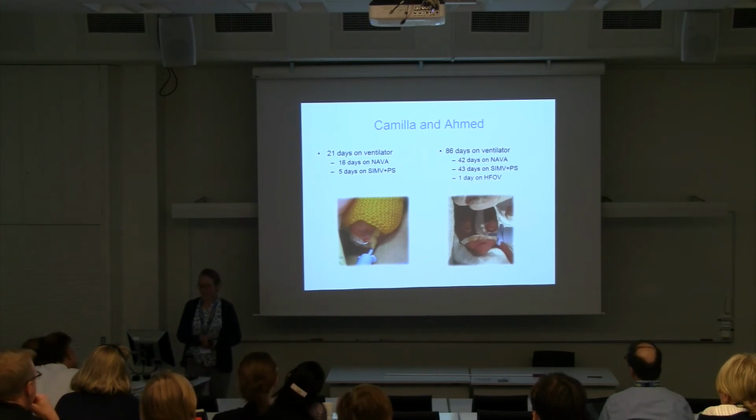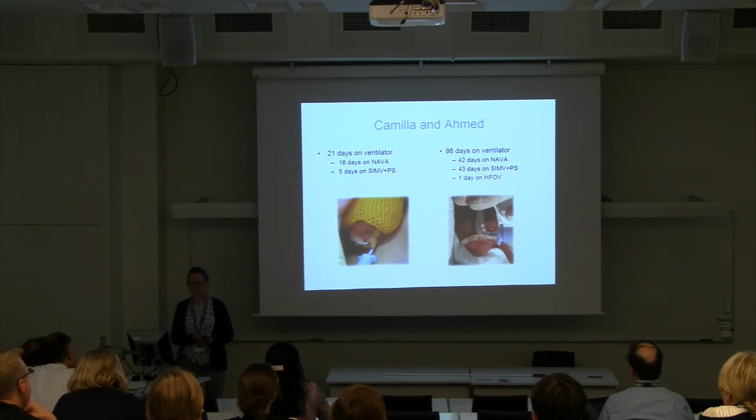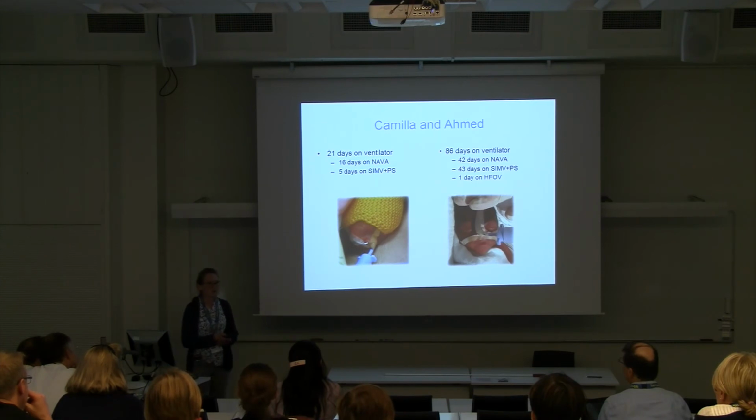And then there is Ahmed, who was almost 3 months on the ventilator, about half of this time on NAVA and the other half on conventional settings. And this is for you to notice that they won't be on NAVA all the time during their time in the NICU, but other ventilator modes are also needed.